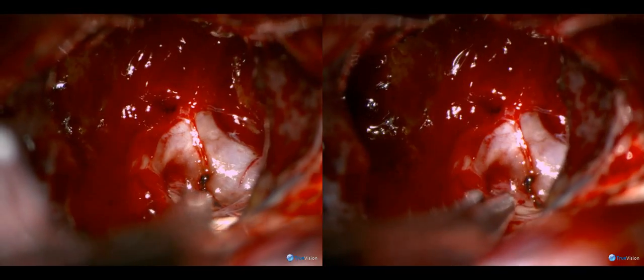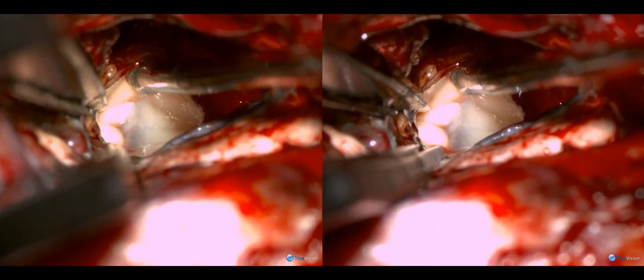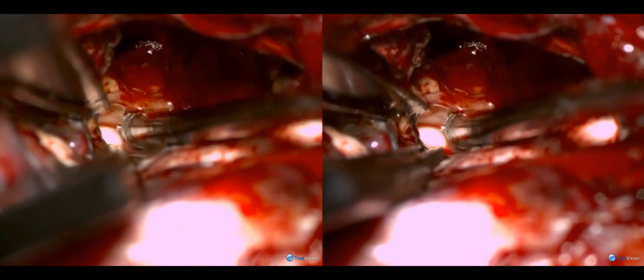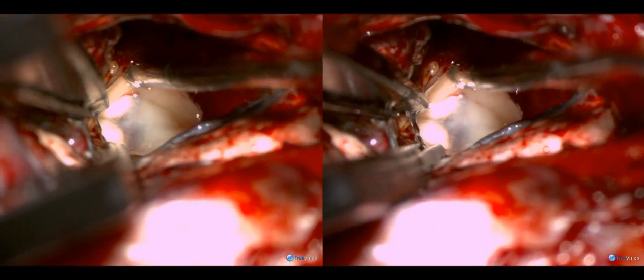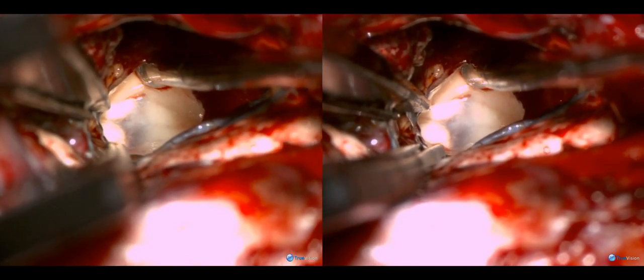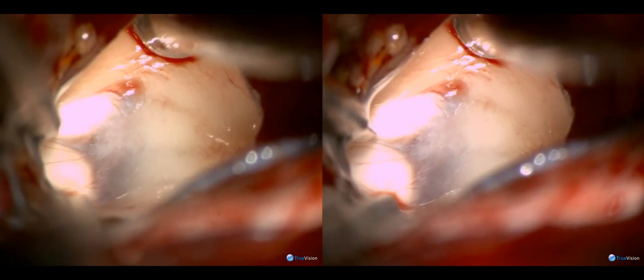This is the view into the third ventricle with the mammillary bodies present, again showing the extent of the reach of this contralateral exposure. The floor of the third ventricle in front of the mammillary bodies has been opened in order to communicate the third ventricle with the interpeduncular cistern.